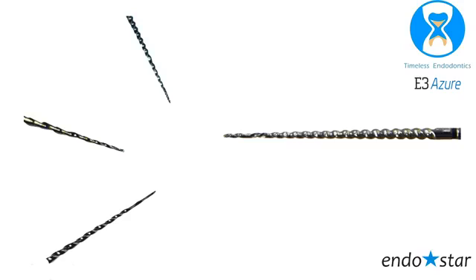As you see in this picture, I'm sorry, now we are at 15 minutes, but I still have time. As you can see here, this is traditional nickel titanium, from the austenite phase. If you see what happened to the file here or here, this is complete cyclic fatigue, and it does not return to its normal shape. It's okay, it's super elastic, but it will not come back to the original shape. This is the case in normal nickel titanium. If you have any file that turns out like this, you have to discard it completely.